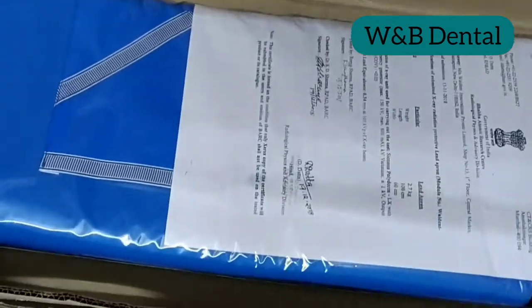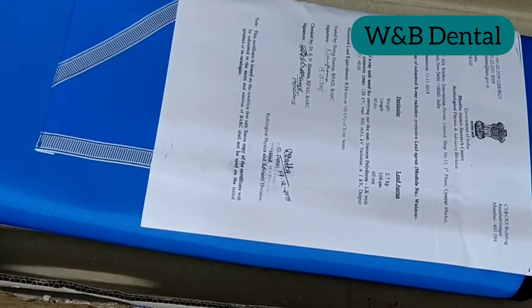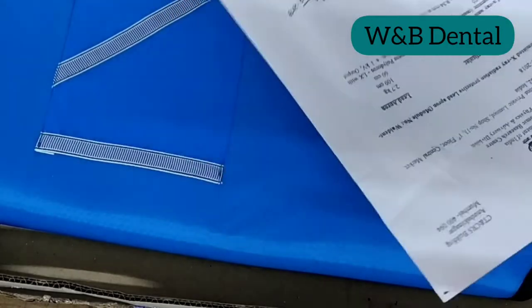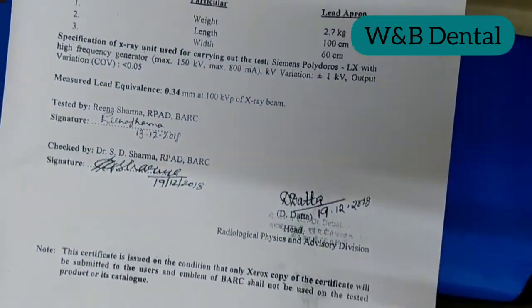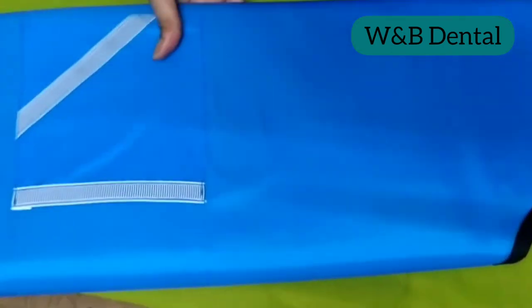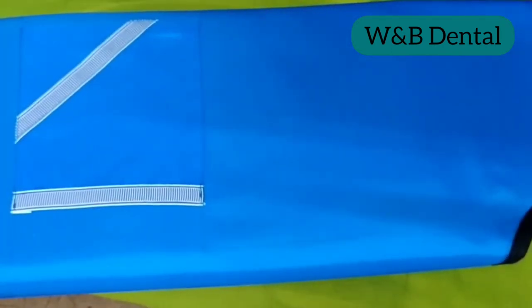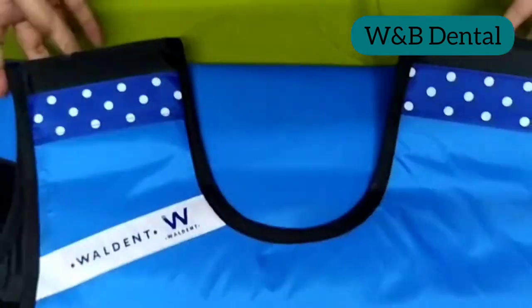The lead apron attenuates radiation and absorbs 90 to 95 percent of scattered radiation. The Walden dental lead apron plus thyroid shield collar offers chest, shoulder, neck, and thyroid protection to reduce radiation dose to organs.